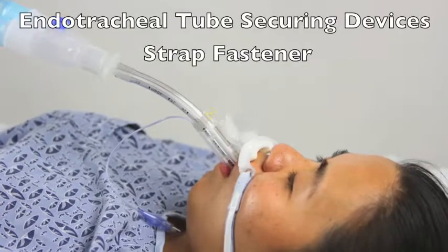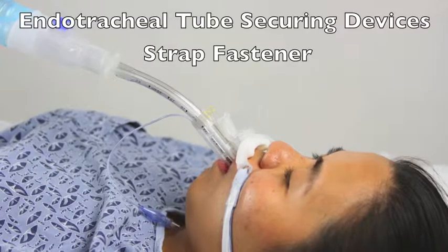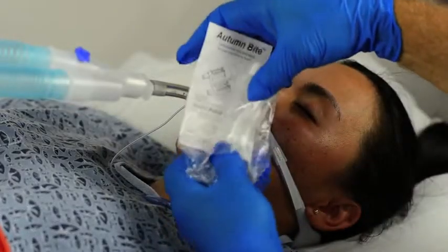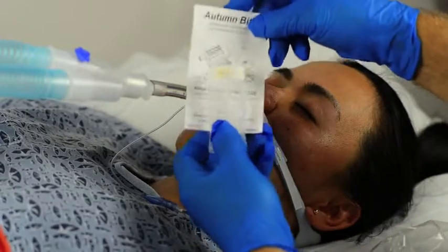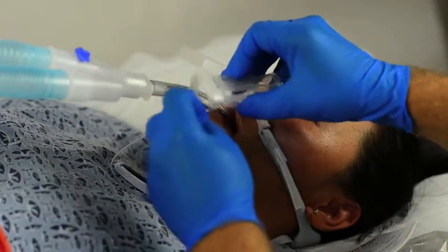First, we're going straight to securing the Autumn Bite with the ET tube strap fasteners. The Autumn Bite is packaged in the open position. Removed from the package, the Autumn Bite can be placed in the left side to align with the endotracheal tube, with the strap only a short distance away from the base.